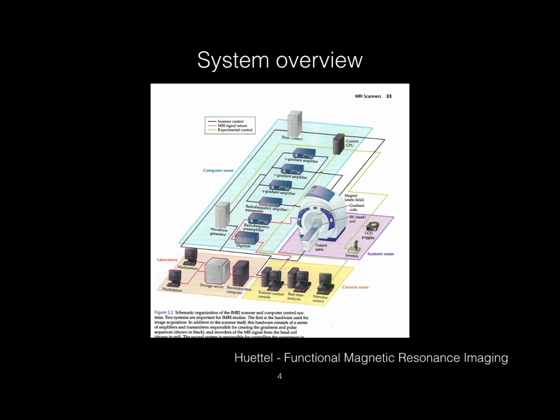And from this area, you typically have access into the scanner room. There will be a rather large dressed up magnet. The whole point of that piece of equipment is that it gives you a very strong, very uniform magnetic field, usually to the parts per million, which is what's needed for the kind of experiments and work that we do.